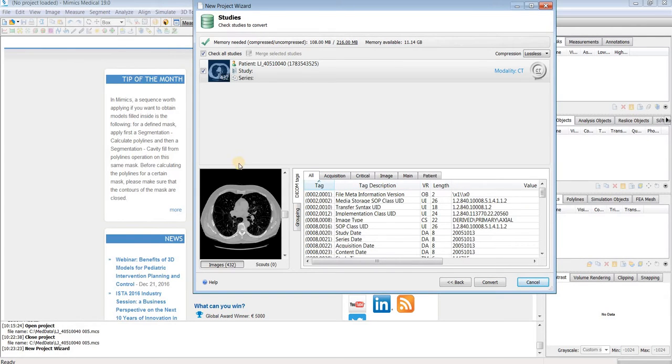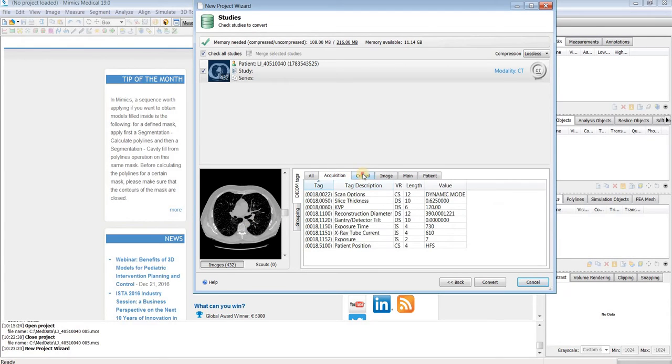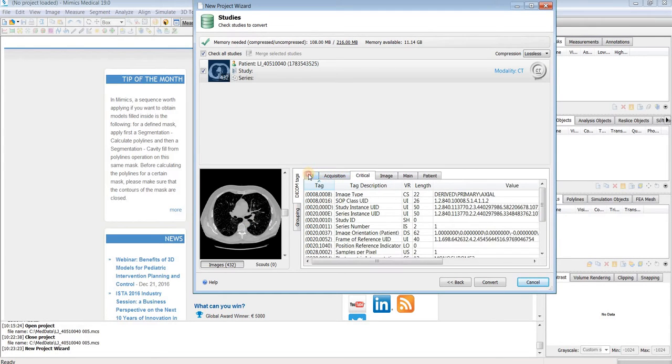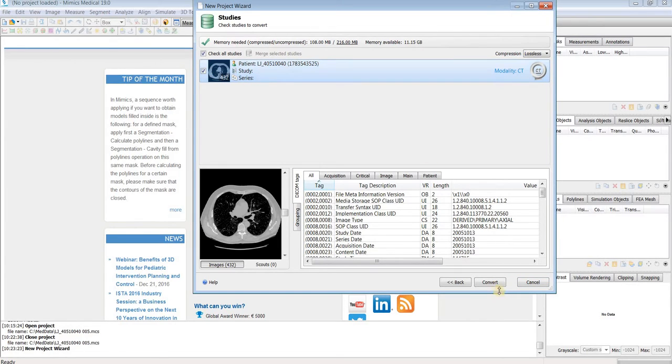This will bring you to a screen where you can see a preview of your images, as well as look at all of the information in the DICOM headers. Once you select the study that you want to import, you can hit convert.